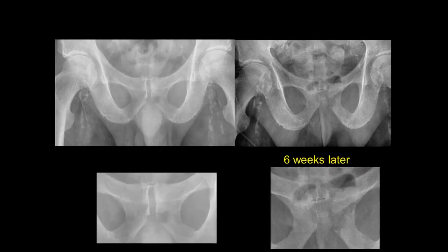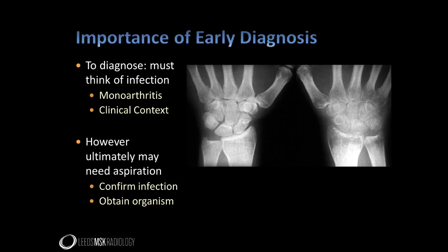Here is another case showing rapid progression of joint destruction in a septic pubic symphysis. Notice that even on the baseline study there is erosive change evident in the left pubic bone. This case of wrist joint infection shows how severe osteopenia can be, particularly when seen alongside the normal contralateral wrist. It is worth always keeping infection in mind when faced with a symptomatic joint — to diagnose it, you need to think of it.